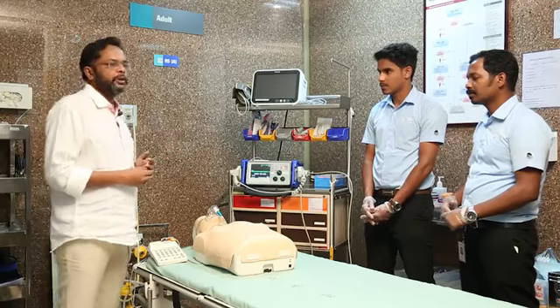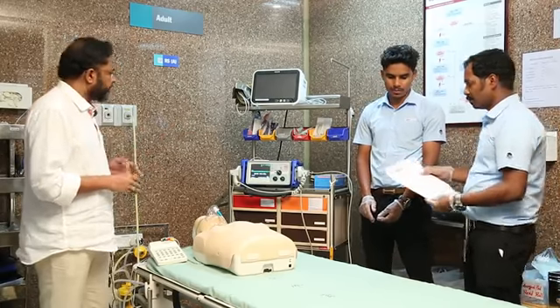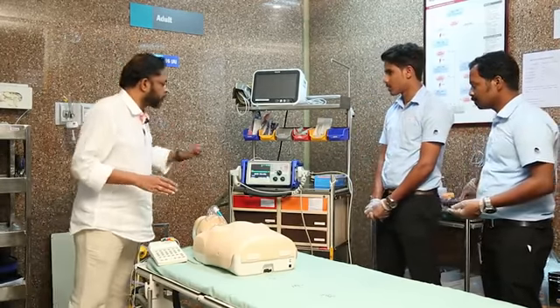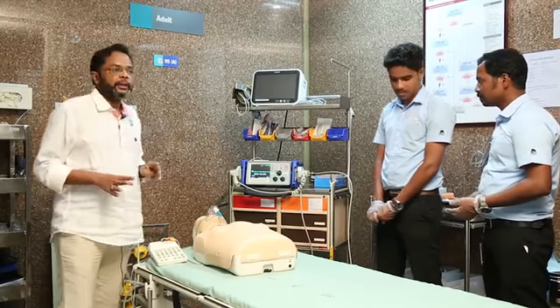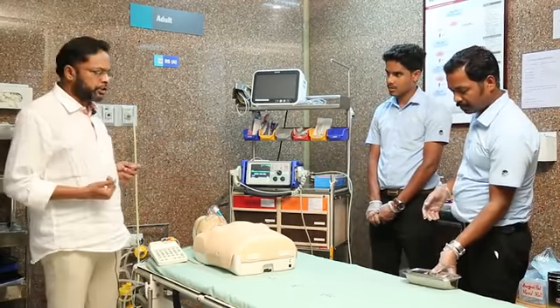Doing the cardioversion is slightly different from defibrillation. Here we have to complete certain formalities. First of all, we have to take the consent of the patient, and a signed consent is required. Second, our crash cart should be ready, with all our resuscitation equipment and emergency drugs nearby. Then we have to explain things to the patient if the patient is conscious.